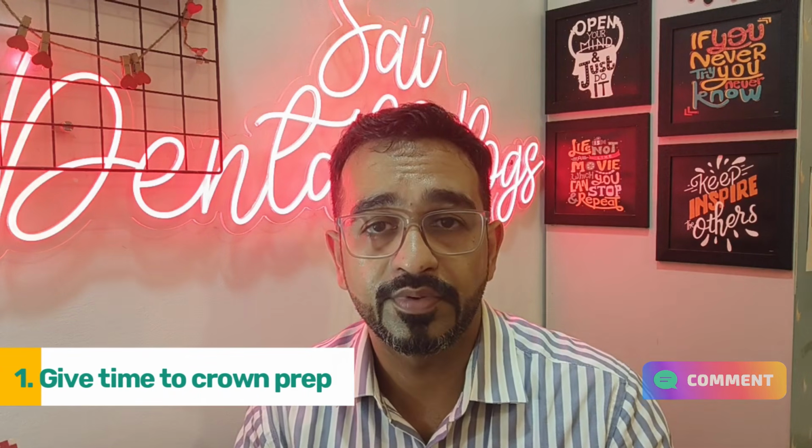So basically the first thing we need to do in crown prep after a root canal treatment is give time for your crown prep. This is a very important thing which I am telling you, because most of the people are busy in doing the crown cutting rather than focusing on the root canal, the tooth structure, the length and breadth of the tooth, and the anatomy of the tooth itself. So you have to see how is the position of your tooth, how much crown is available actually. Minimum 4 mm of crown height is required for the crown to retain.